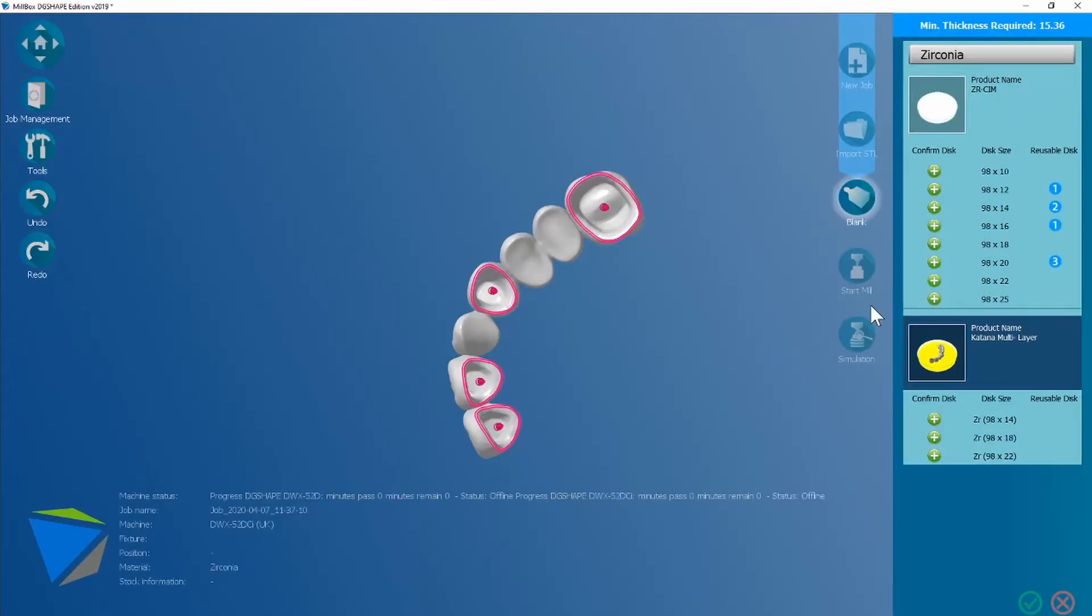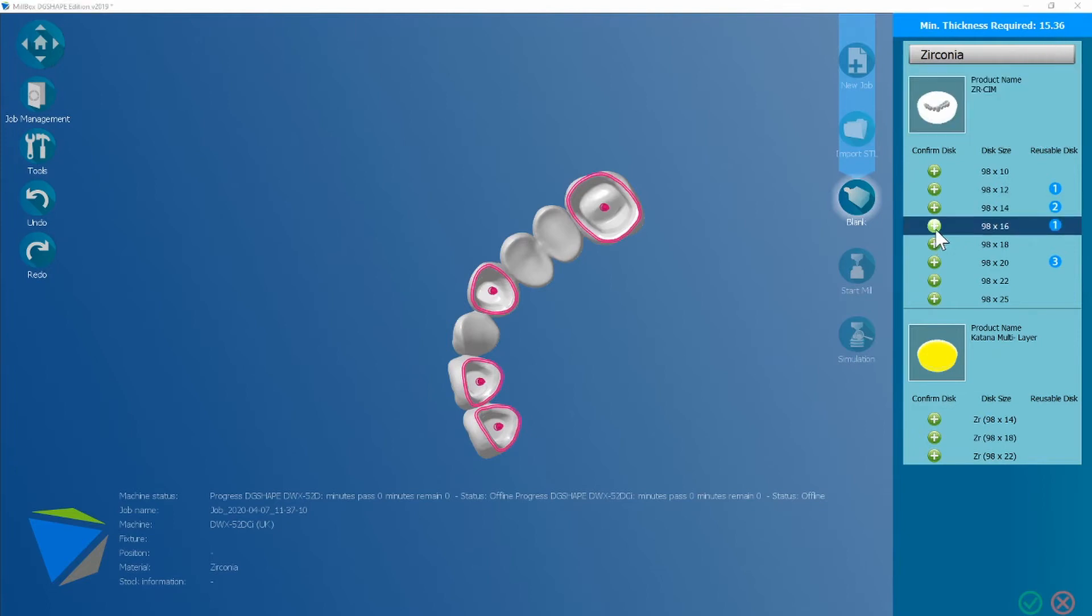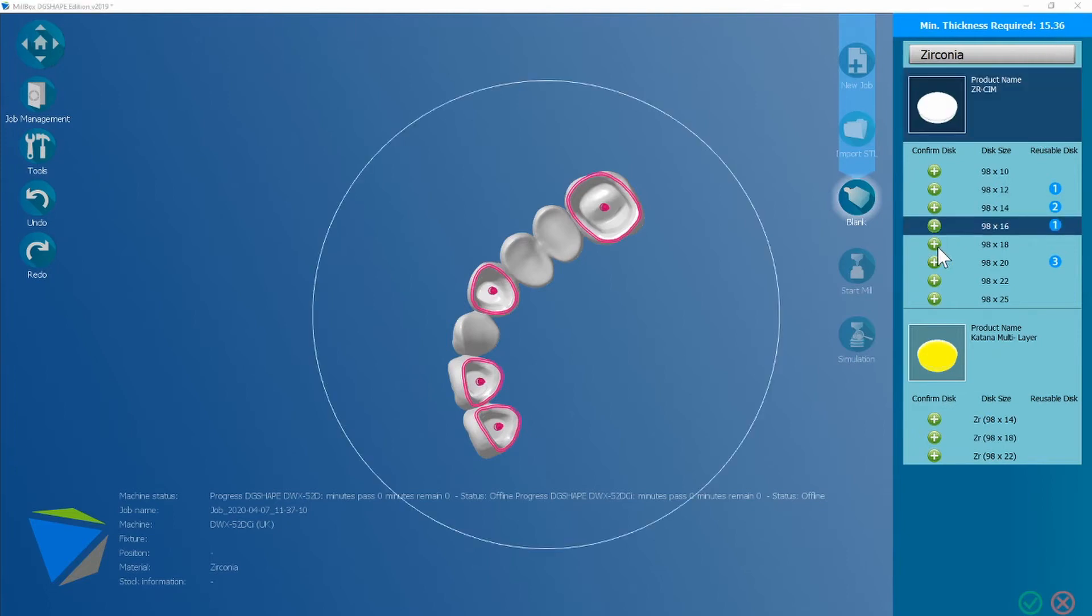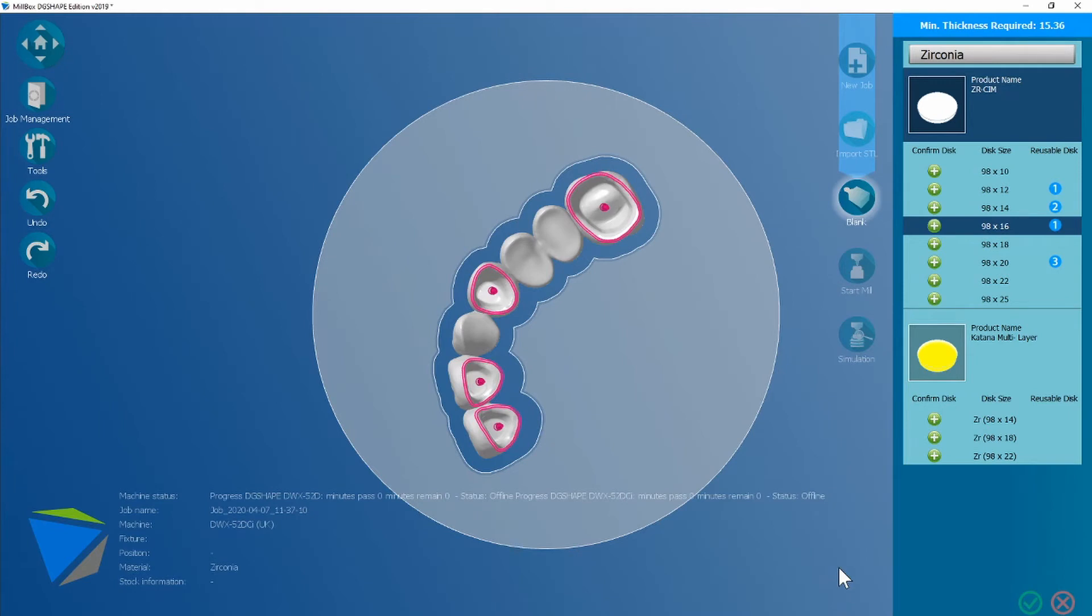Okay, you can see that the disk is going to require a bigger size so we're going to choose a new disk of 16mm, hit test. We're going to use a lot code of 2 as an example this time. It's going to automatically nest the bridge again like the crown workflow before.